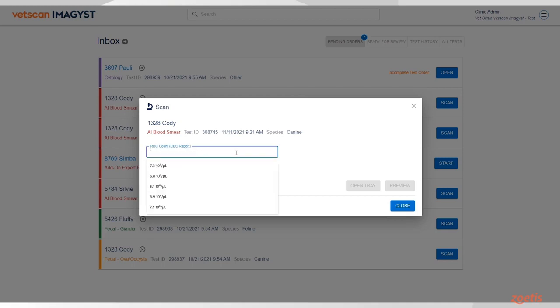Next, type in the red blood cell count from your CBC report to ensure the Imagist can provide an estimate of the polychromatophils, which gives us an indication of the number of reticulocytes.